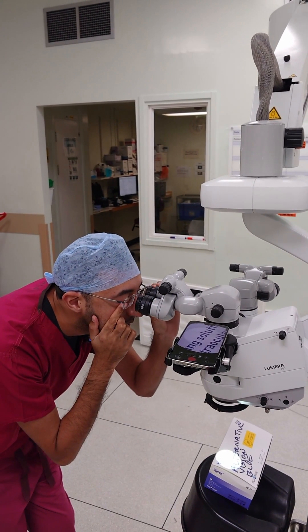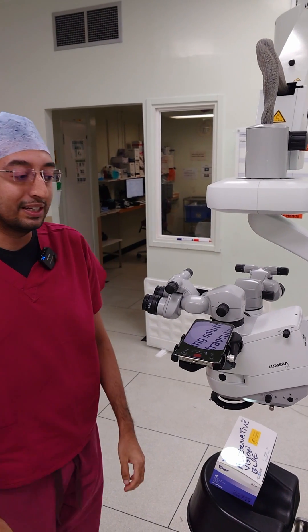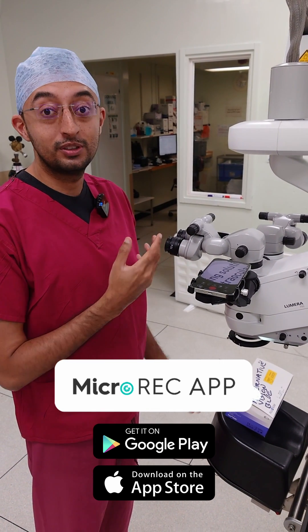Then I'll cover this eye, and then you've got perfect focal quality. Everything on the phone screen and your MicroREC is going to be in perfect focus, and so will your surgery. So enjoy.